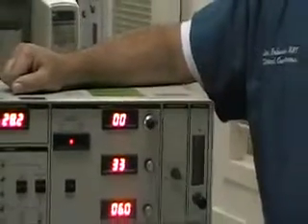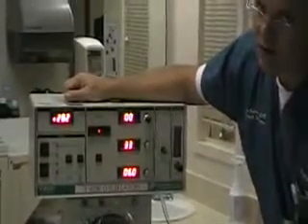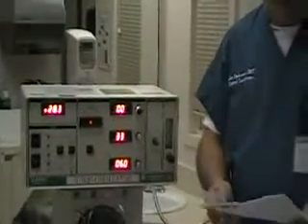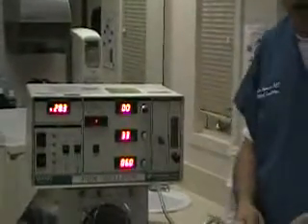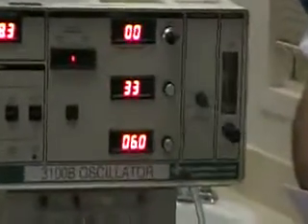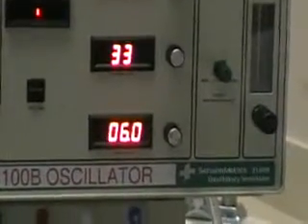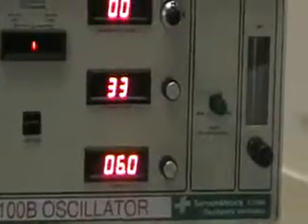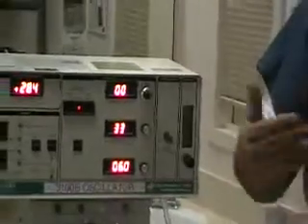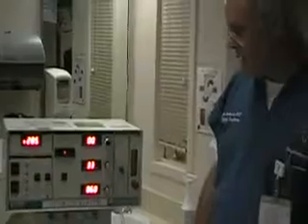And according to our policy, what we're going to do as far as hertz are concerned is we're going to get a blood gas and we're going to set our hertz as far as our blood gas is concerned. So if we have a pH of less than 7.1, we're going to set our hertz at 4. If our pH is 7.1 to 7.19, we're going to set it at 5. And if our pH is 7.2 to 7.35, we're going to set it at 6. And if it's greater than 7.35, we're going to set the hertz at 7. This is a good way to start initially the frequency that you want for your high-frequency oscillator.